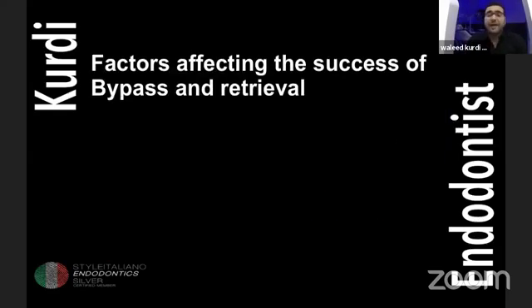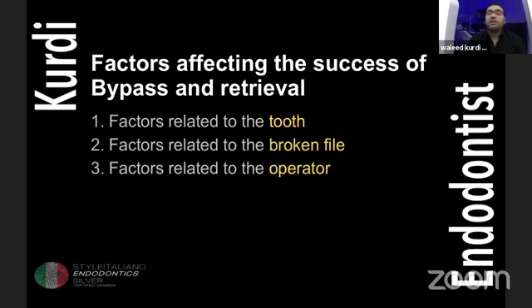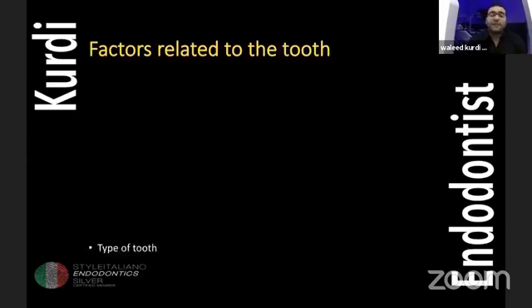All right, now we have to simply talk about factors affecting success and failure of bypass or even retrieval. We have factors related to the tooth, related to the broken file, factors related to the operator, and factors indeed related to the patient. First, factors related to the tooth.